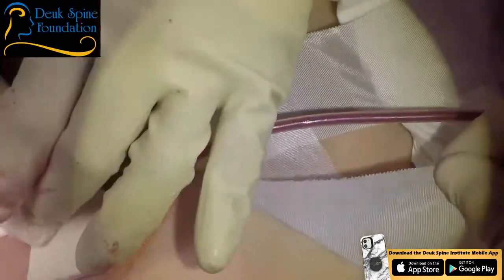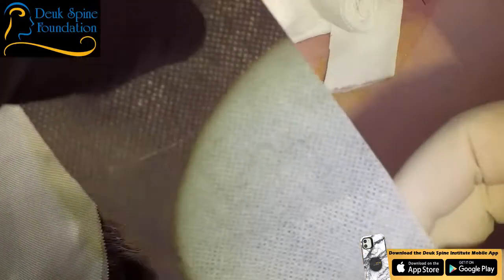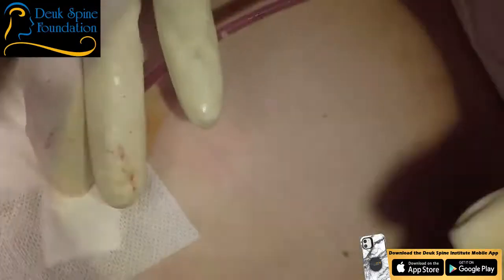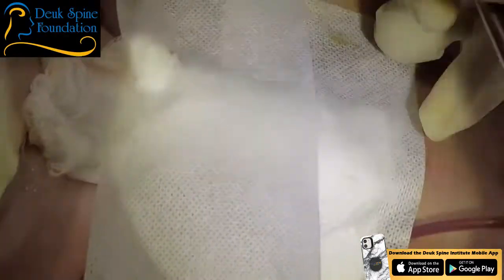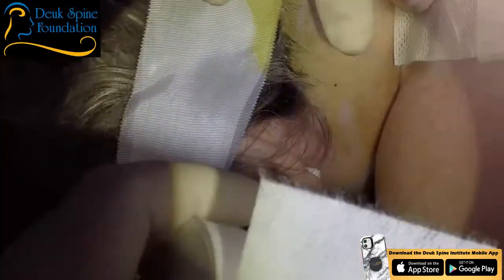Let's get this off. I'm going to put this bandage on, and then we're going to get her out of pins, and we're going to roll her onto the gurney. Okay? Give me a second. I'm going to put the paper tape on. All right. Good. That's what we're using. Let me get the bottom first, right where your hand is. Let me have it. I don't like it unwound that much. As long as your blood pressure is controlled.